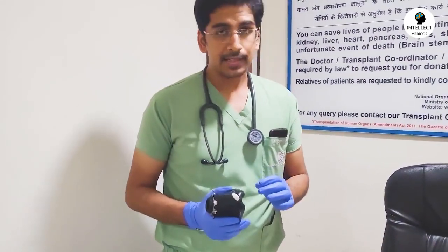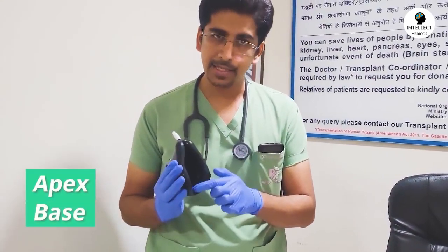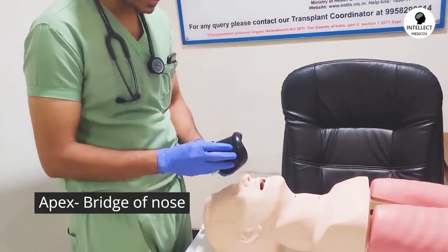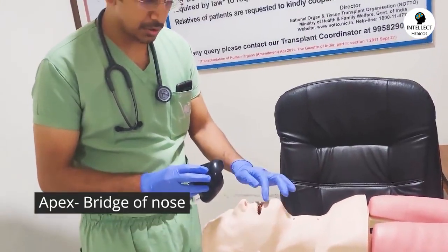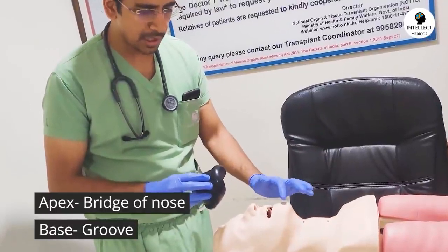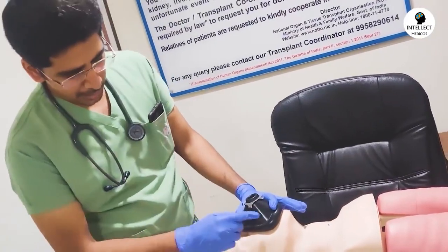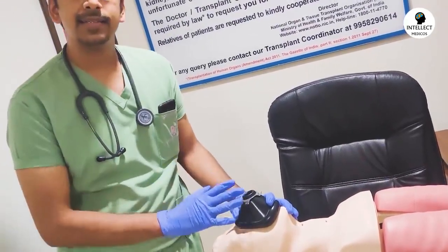Now how to check whether this is appropriate or not? This is the apex of a mask and this is the base. The apex should lie at the bridge of the nose, whereas the lower margin should go in the groove between the lower lip and the chin, like this. If you are not able to fit it, that means that size is inappropriate. You need to change. You need to have a larger or smaller size, depending on the patient's face and anatomy.